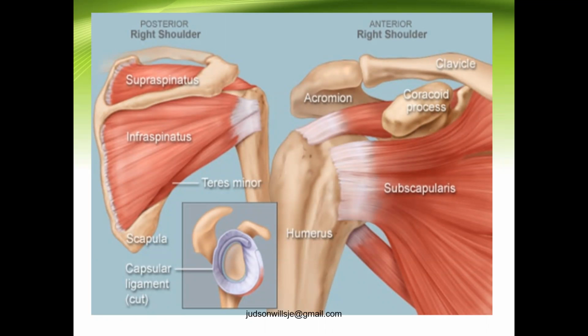In some cases, an MRI is the best tool to help doctors track the effect of surgeries, medications, or physical therapy on your shoulder joint.